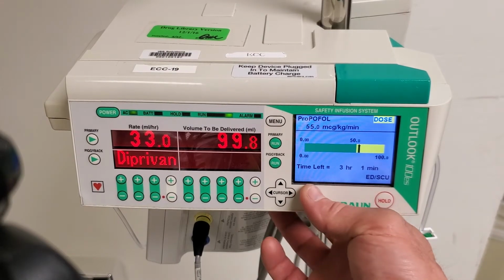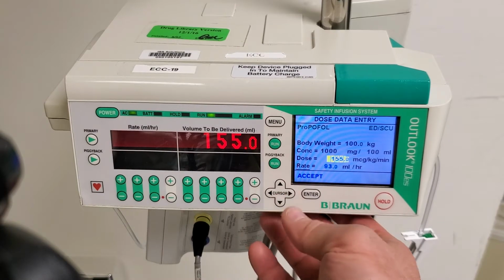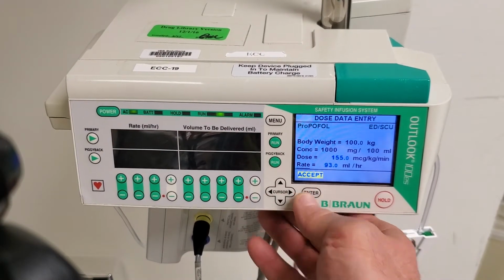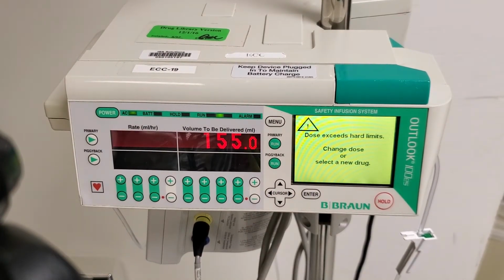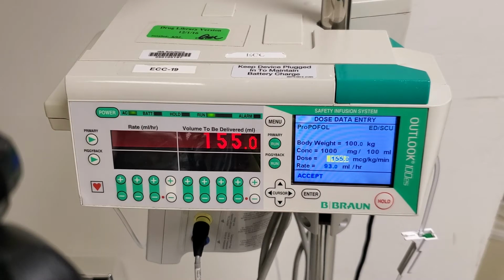Now if I try to deliver this at over 100 mics, notice it will not allow me to do it. Dose exceeds hard limits, change dose, or select new drug. Okay, so we're going to stay at 55.